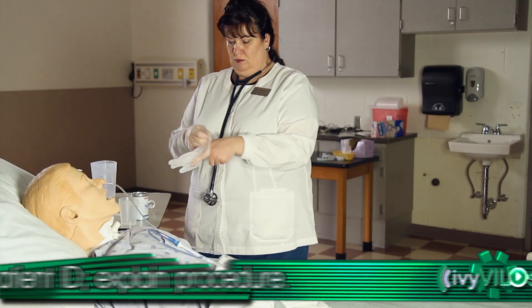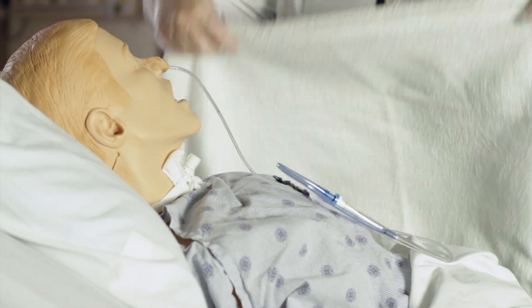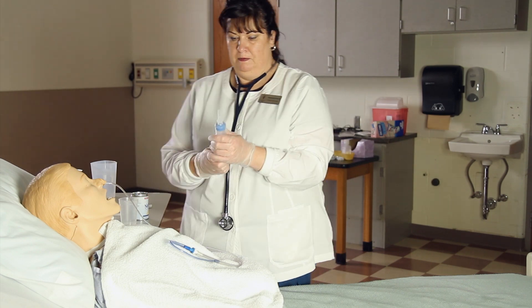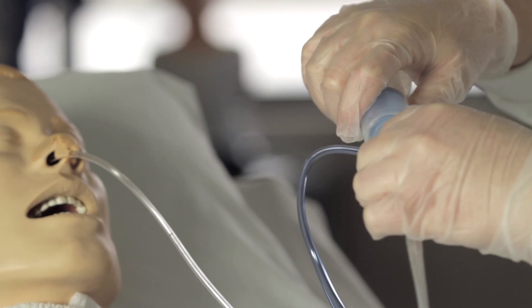Put on clean gloves. Drape a bath towel over the patient's chest. Attach syringe to NG tubing and auscultate over the gastric body to determine placement.